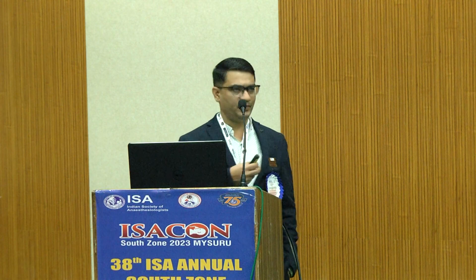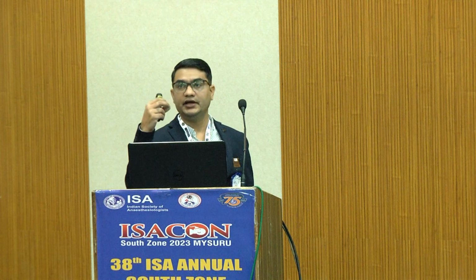So how to troubleshoot in these cases? The problem is you must correct the primary causes, and it takes time. You can't immediately correct the blood pressure. Even if you give vasopressors, what happens? Vasoconstriction increases. Still, you will get dropouts. One is a low perfusion signal, extremely low, and you have to amplify the signal. Amplification will actually produce noise.